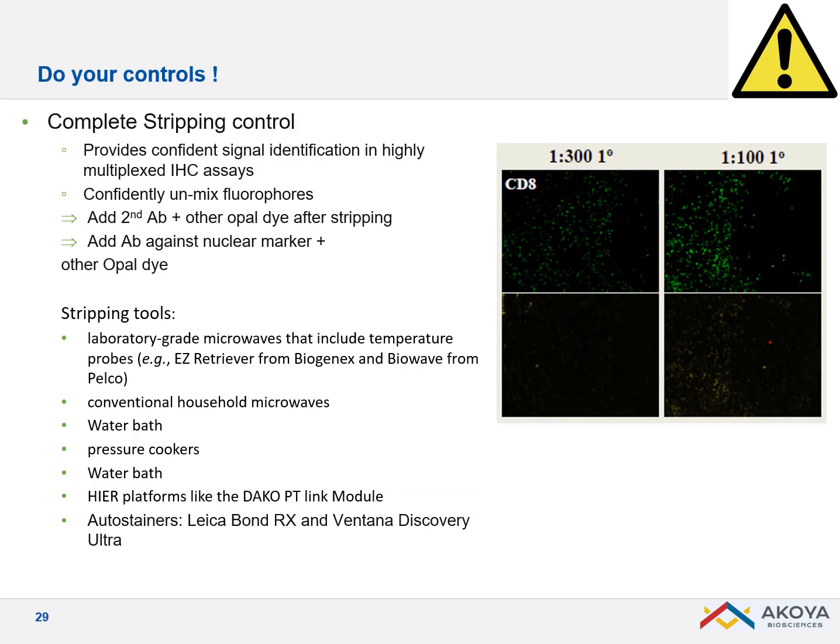Always do your controls. When starting with new antibodies and a new stripping method, make sure stripping is complete. One approach: perform a full staining cycle with OPAL 520, strip the antibody, then apply just a secondary with another dye such as OPAL 620. If stripping isn't complete, you'll see leftover signal co-localizing — meaning the secondary is binding to remnants of the primary.